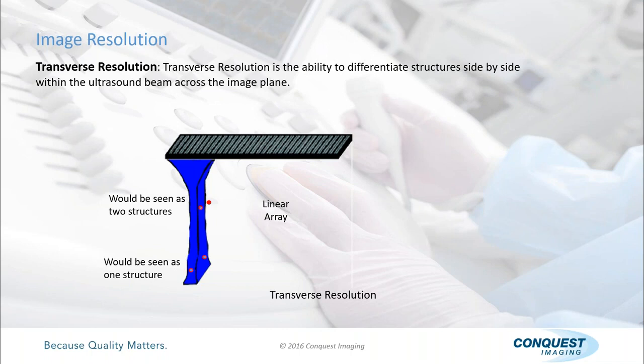Now, there's no requirement by any accreditation agency to measure transverse resolution. And can you do it on this Phantom? It's not easy because there aren't objects front to back. They're all cylinders going all the way through the Phantom. But if you were to change it this way, then you could see objects going front to back, because now their orientation is this way.